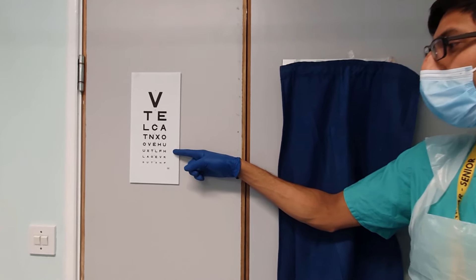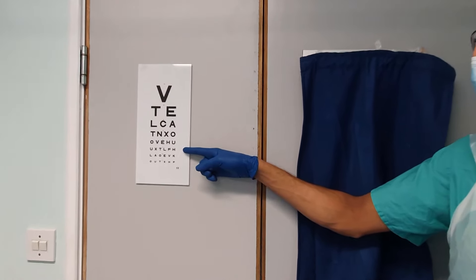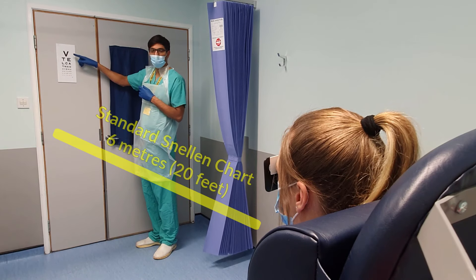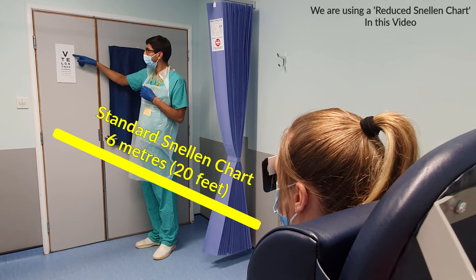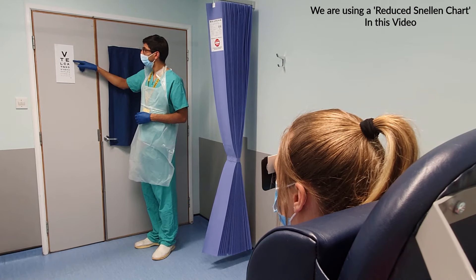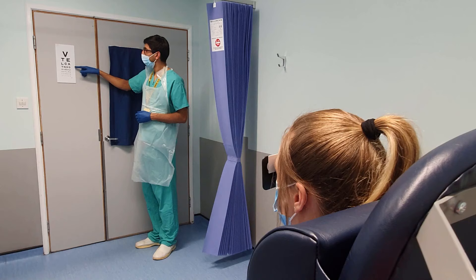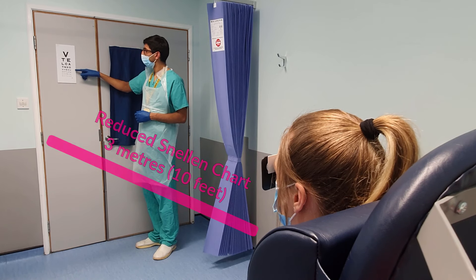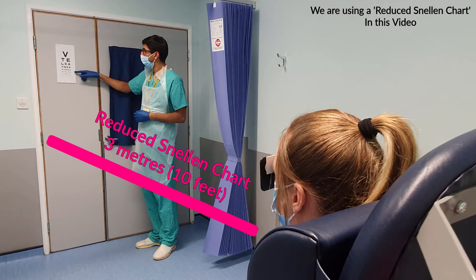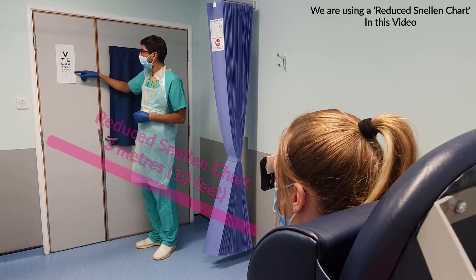The standard Snellen chart uses optotype letters that should be read at a total distance of 6 meters or 20 feet. However, you may find that your setup is slightly different, using a mirror at 3 meters or a reduced Snellen chart — a scaled-down version which you read at 3 meters instead of 6 meters. This is what we're using today.